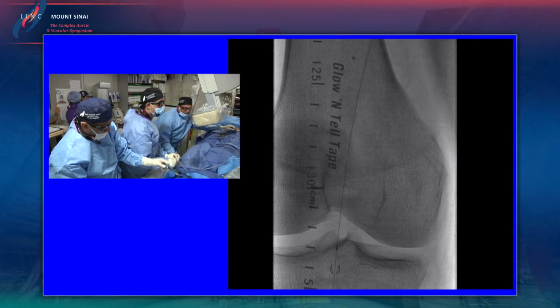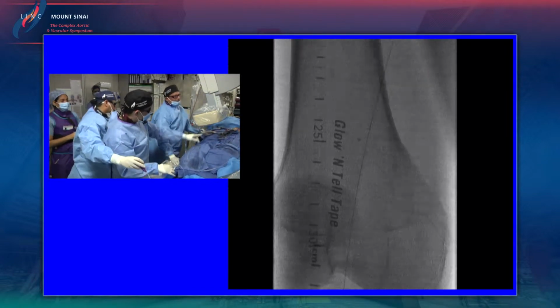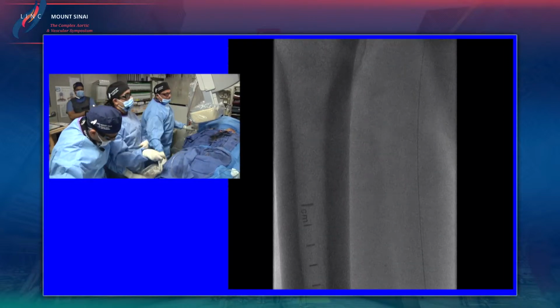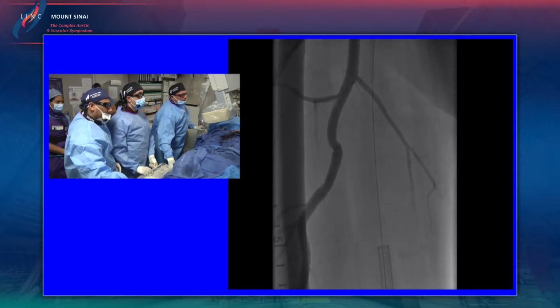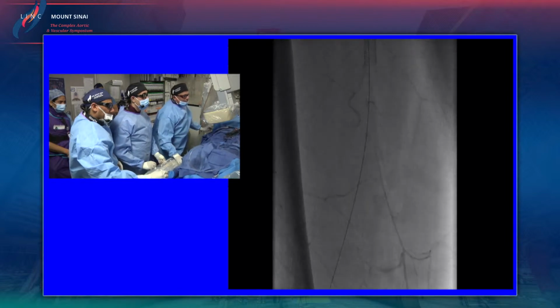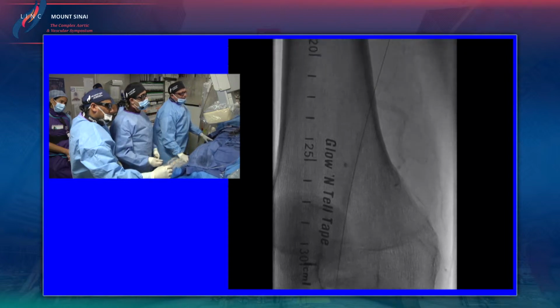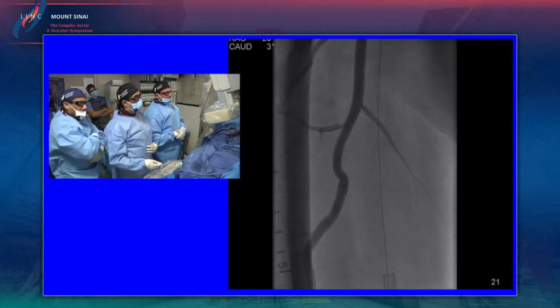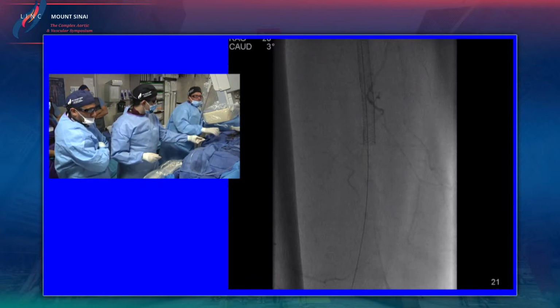Yes, sir. No, I'll just do a regular run. Okay. Mag out? Yeah, I think you just mag out and just do a regular run. So we're just going to do a regular run here in the last few minutes just to see. Inject. Yeah, it looks like we have some debris down there. Let's see. No, I think it's all recoil. Don't you guys agree? This is extreme recoil. This is more a re-occlusion.